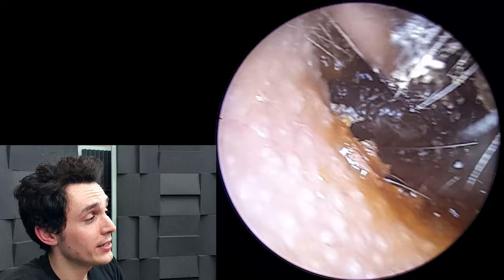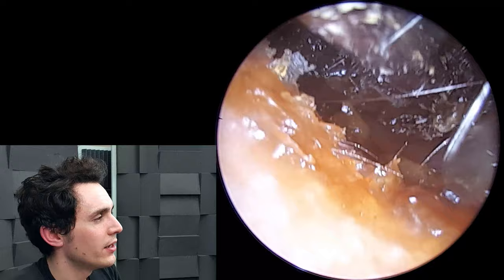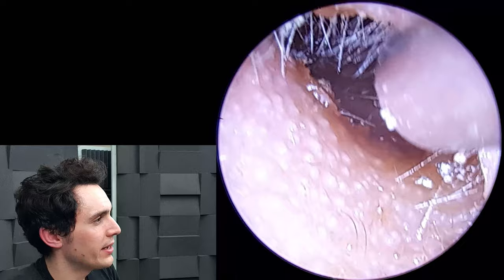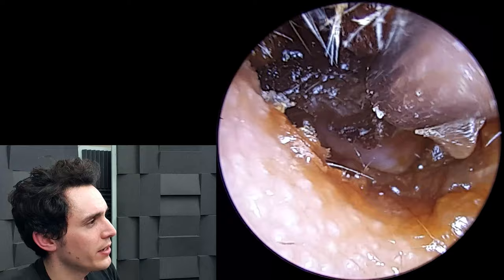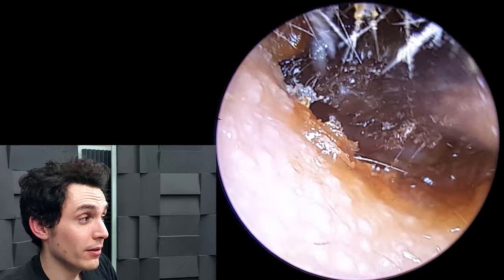At this point it's actually so large that I'm struggling to get it out of the ear canal. We're going to switch back to a regular suction probe — the fine end just isn't cutting it. I'll go back in with a regular probe and I should be able to drag it out. This peripheral wax is just ordinary brown wax, not the plug.